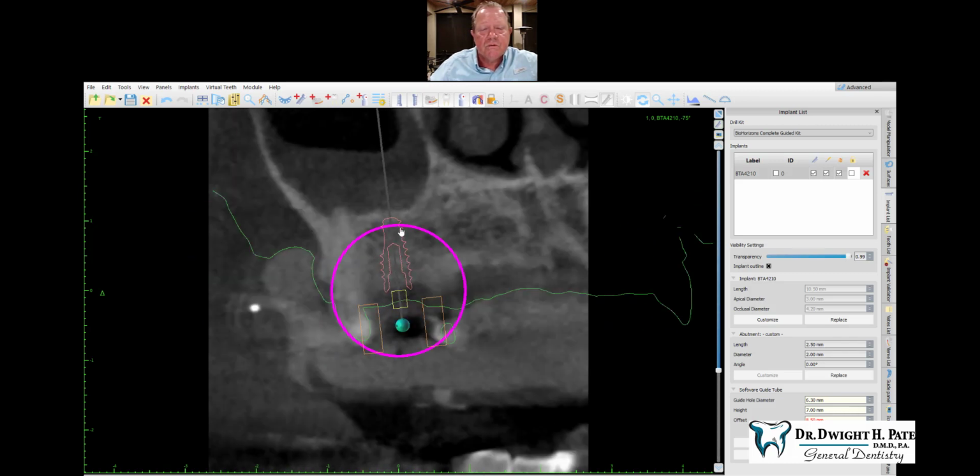Now once you drill to this point and you have your osteotomy set, once I have my pilot drill completely done, I actually like to switch over to freehand and freehand the bump from there. I'll start at this position, insert my pilot drill into the osteotomy, and I'll take a measurement on the crest of bone where that crest touches the pilot drill. That becomes my short length.